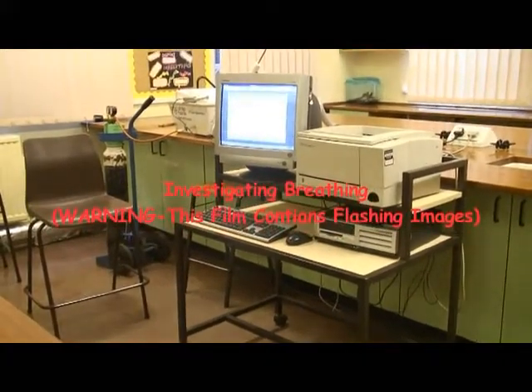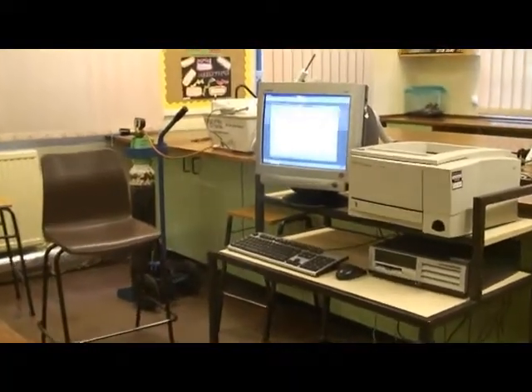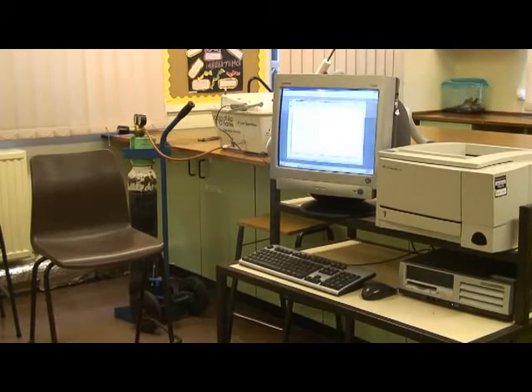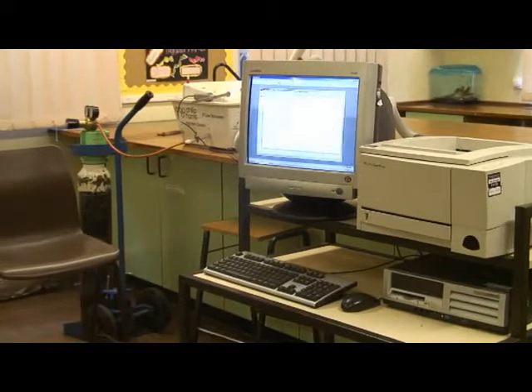This shot shows the basic spirometer setup. On the extreme left behind the chair is an oxygen cylinder, next to that the spirometer itself, next to that flashing on this video is the monitor screen, and next to that a computer with printer, keyboard and so on for printing out final traces.